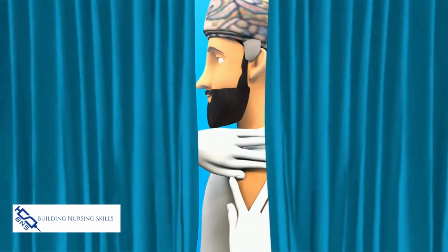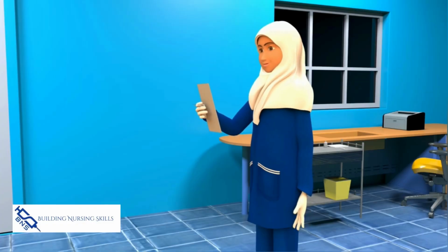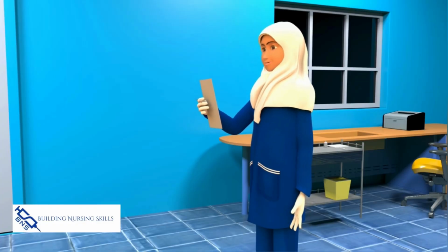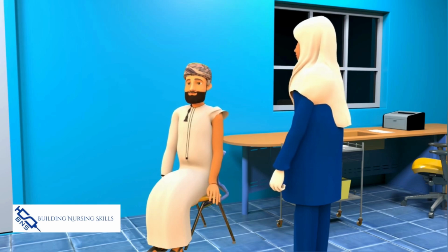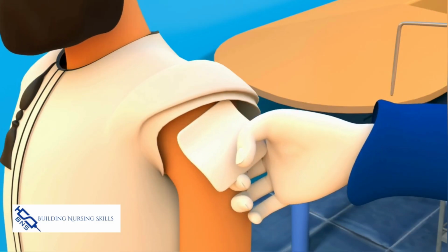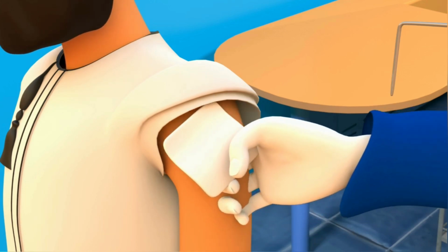Locates an appropriate injection site depending on the amount of medication to be administered. Verifies the site is free of pain, infection, bruising, and abrasions. Positions and drapes the patient appropriately and asks to relax the muscle. Cleans the injection site with an alcohol pad using a circular motion outward, allows the skin to dry.